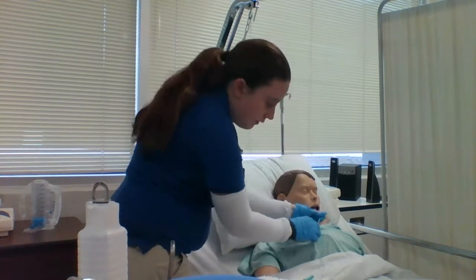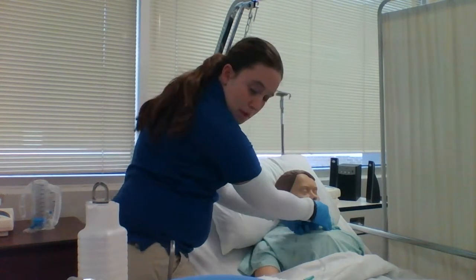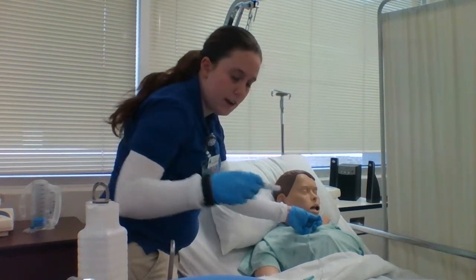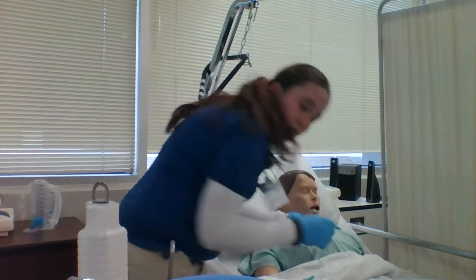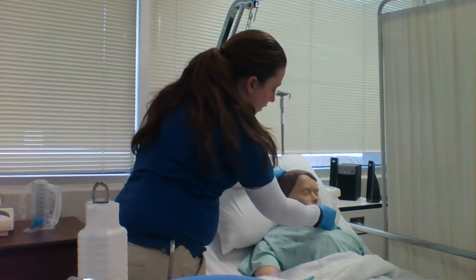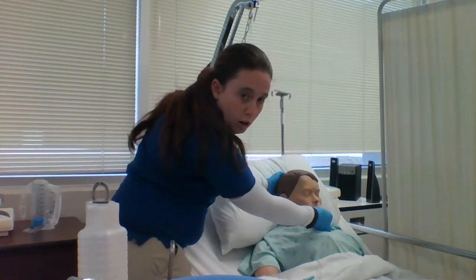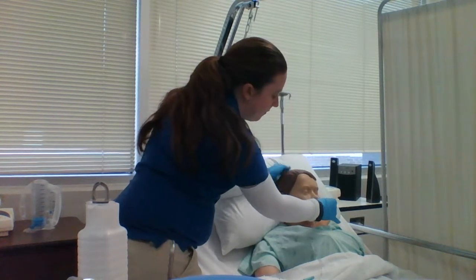Now I'm going to have him recheck the back of the throat for any coiling. Okay, there's no coiling, and I'm going to have him take a sip of water. And with each swallow, I would advance the tube further until placement is reached.